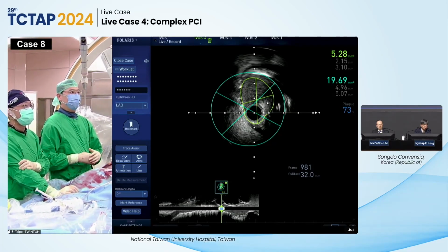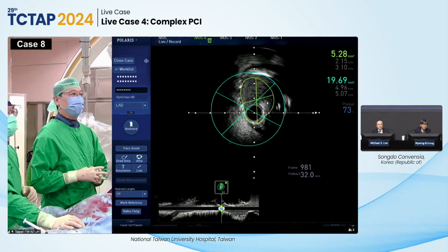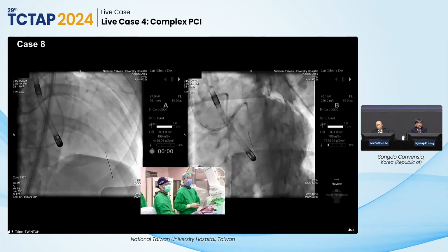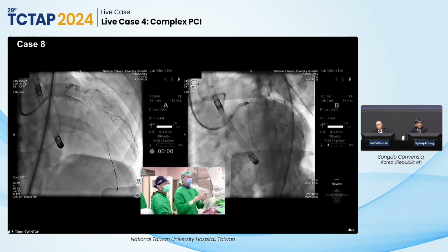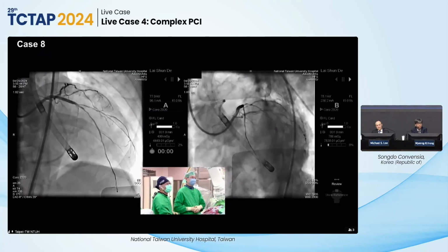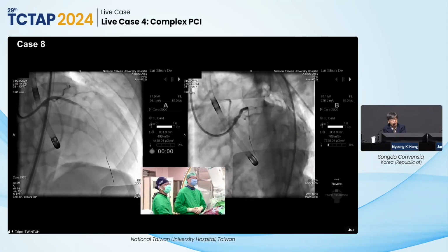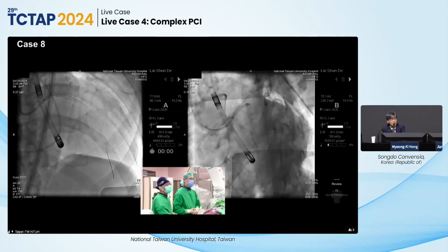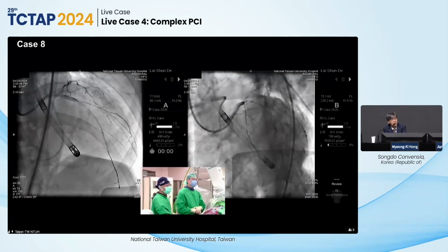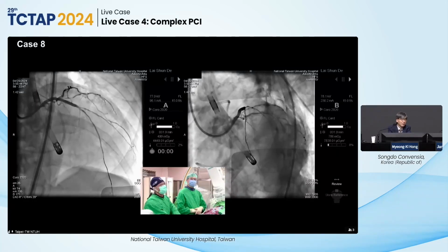And I think we're done with this bifurcation procedure from the angiogram. Let's show the angiogram. The circumflex flow was good from the lateral projection. So maybe we are going to focus on the narrow part of the stent and optimize the stent result. Even though the ostium of the circumflex is quite severely narrowed, the TIMI 3 flow, I like that so far. It is good. If you want to fix it at the circumflex and touch it, I think it may cause a new complication. Yeah.